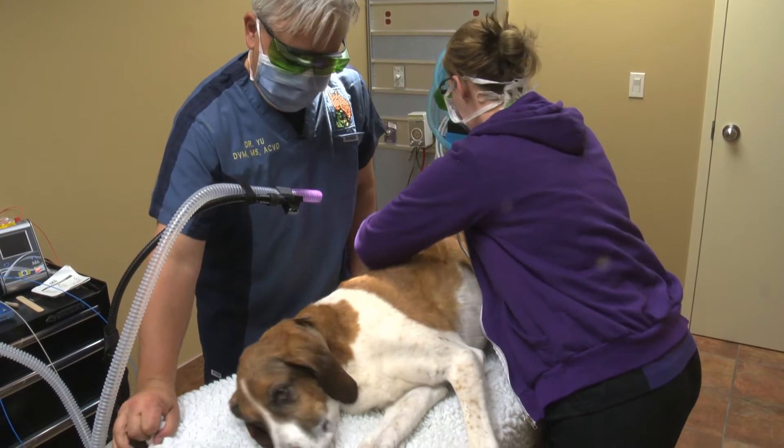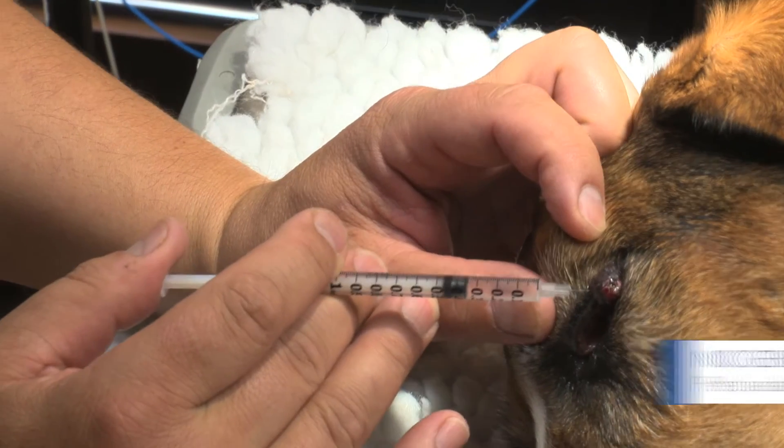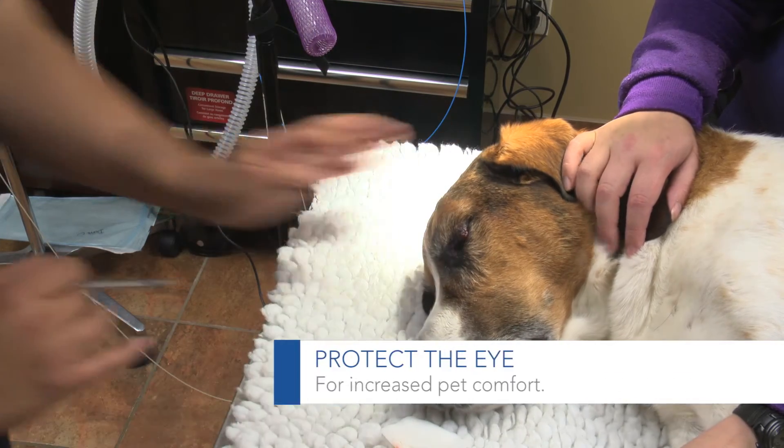We're going to be removing this meibomian gland adenoma off of the eyelid. We're going to inject a little bit of local anesthetic right into this area, just using a 27 gauge needle — a fine needle.